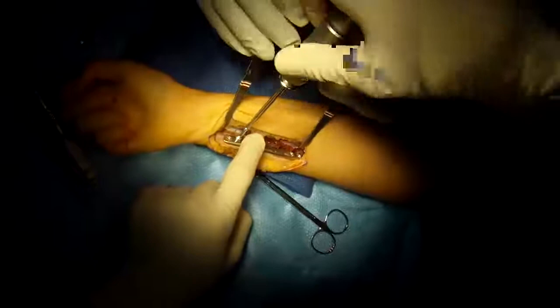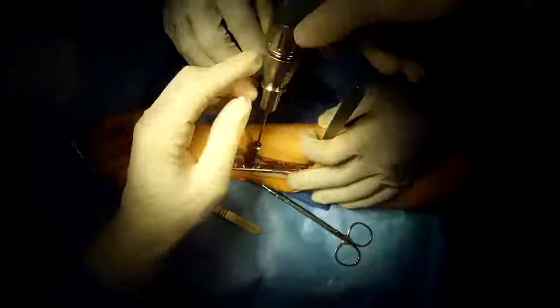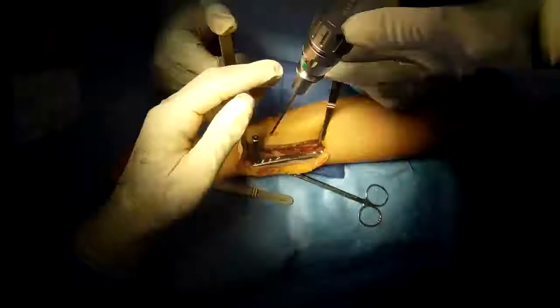We're placing these locking screws, which are special — they have separate threads that lock into the plate to increase the rigidity of the fixation by a factor of five, at least. Placing a number of these through special guides.